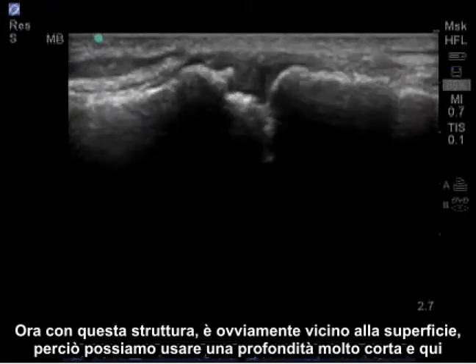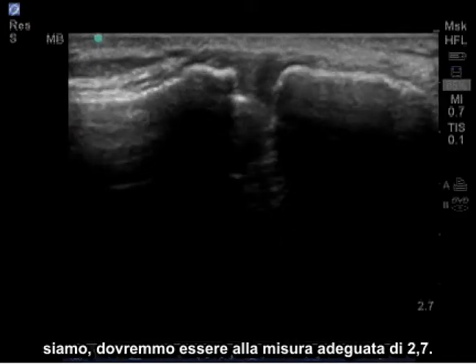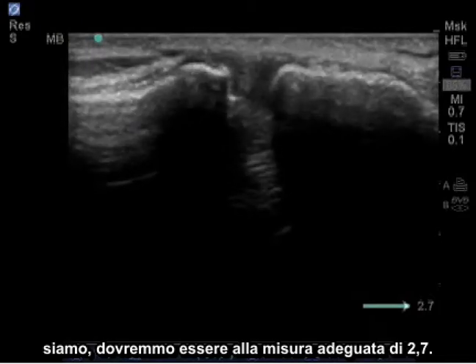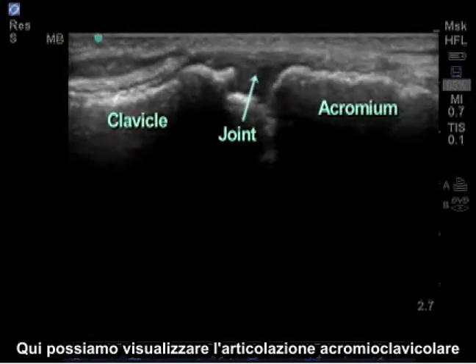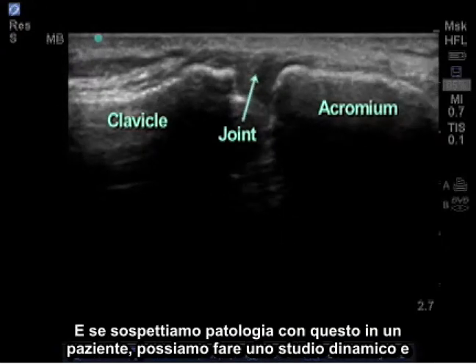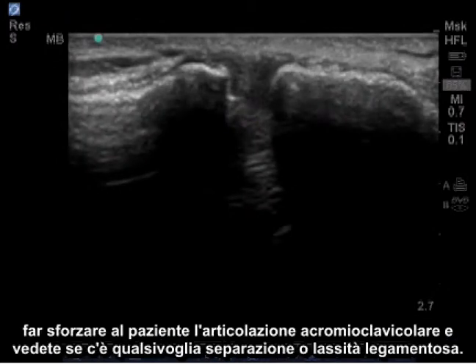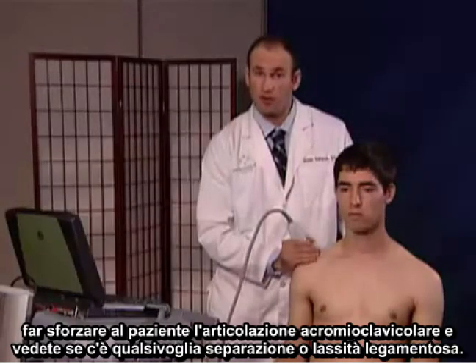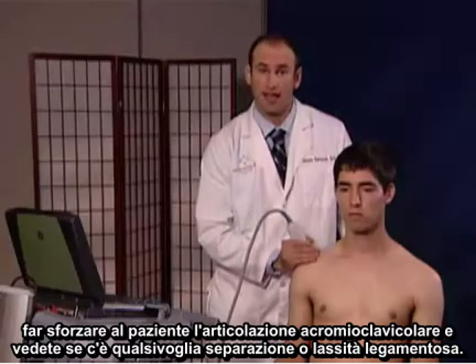With this structure it's obviously close to the surface, so we can use a very short depth — and here we are, which should be adequate at 2.7. We can visualize the acromioclavicular joint, and if we suspect pathology we can do a dynamic study and have the patient strain the AC joint to see if there's any separation or ligamentous laxity.